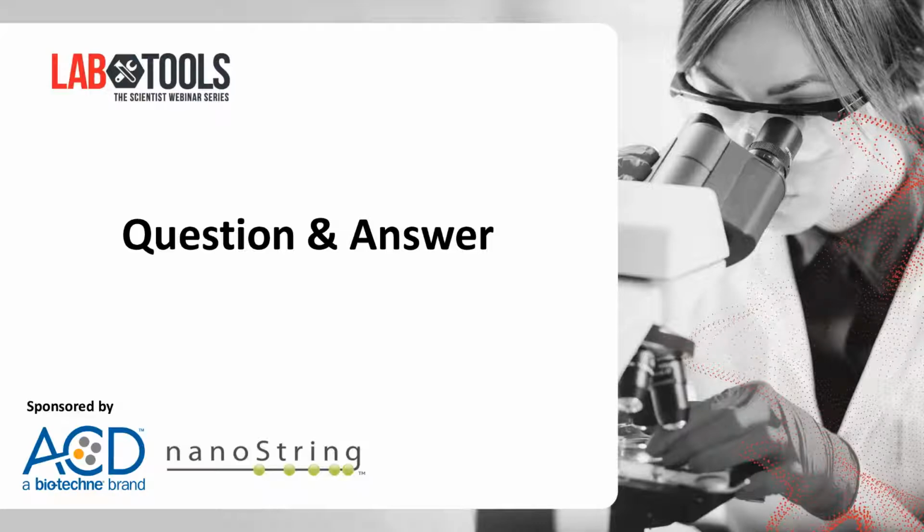That's a really good question. So the DMD mirror device on the digital spatial profiler, the GeoMx DSP, is highly tunable down to 10 microns, and can be used to illuminate a single cell. But it ends up being all about how much you are actually going to be collecting from your particular regions of interest. That translates directly into the amount of material that you're going to read out.